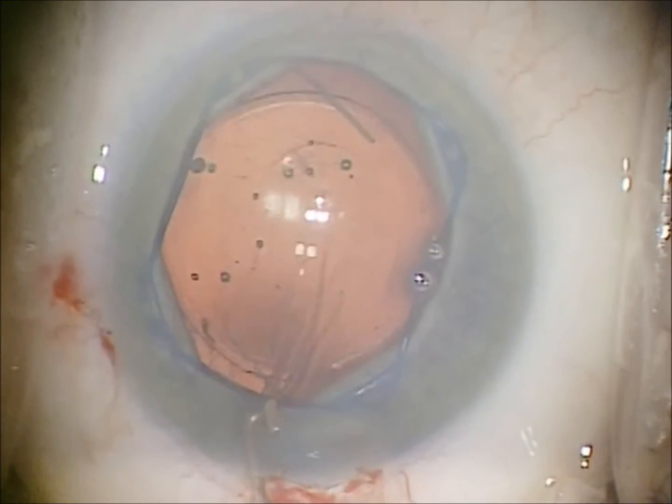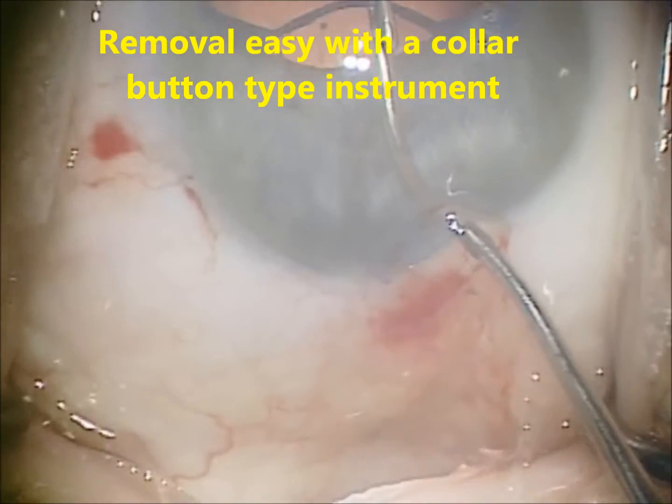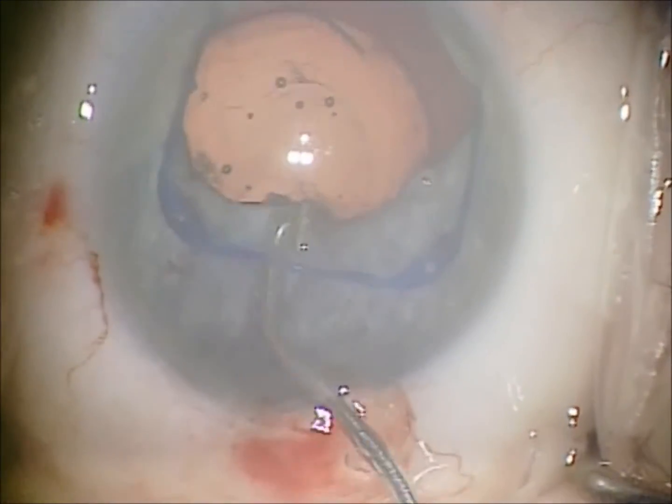It's best to use a collar button type instrument. You simply push the leading edge away from you to disengage the two corners that are closest to you, and then hook and pull out to remove.